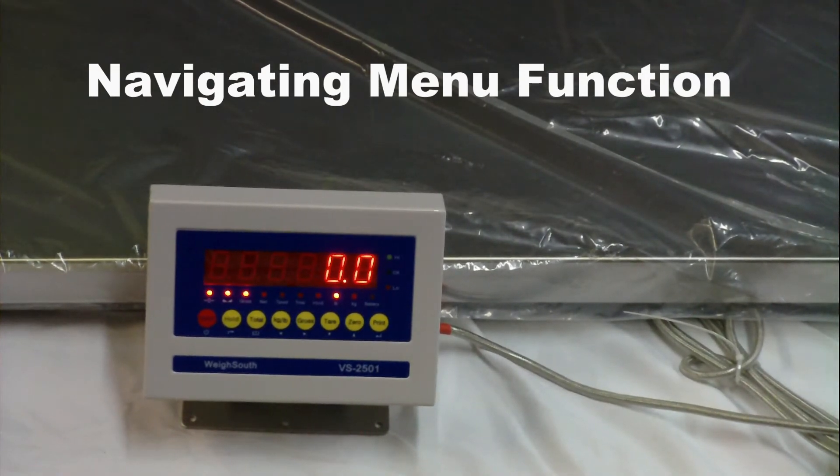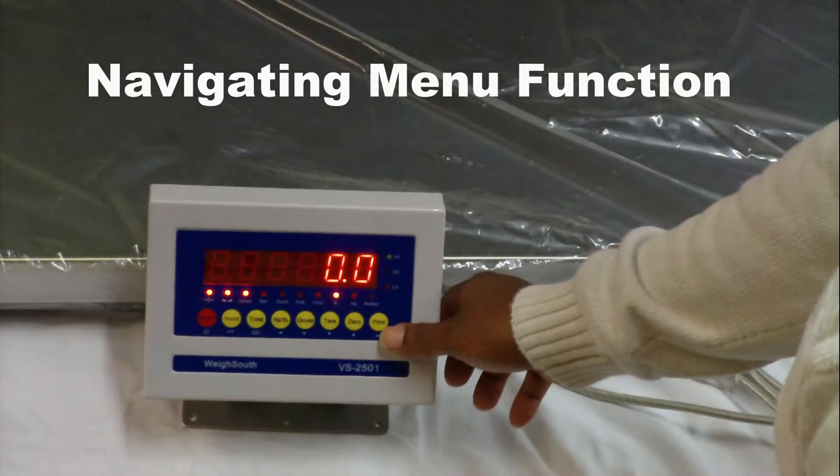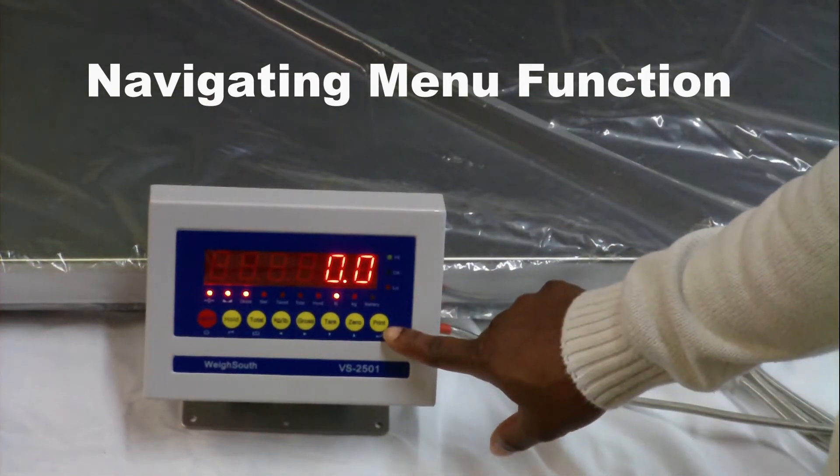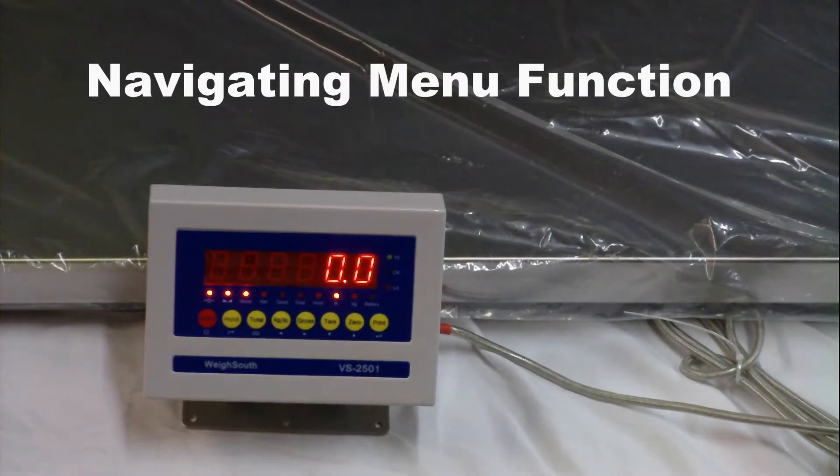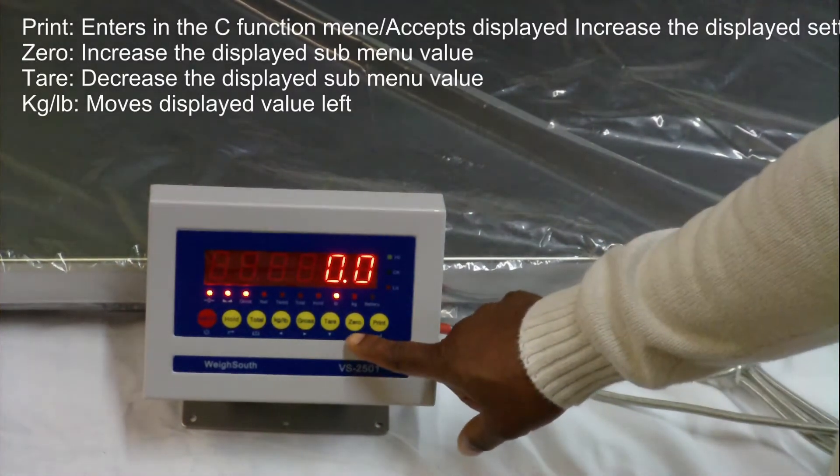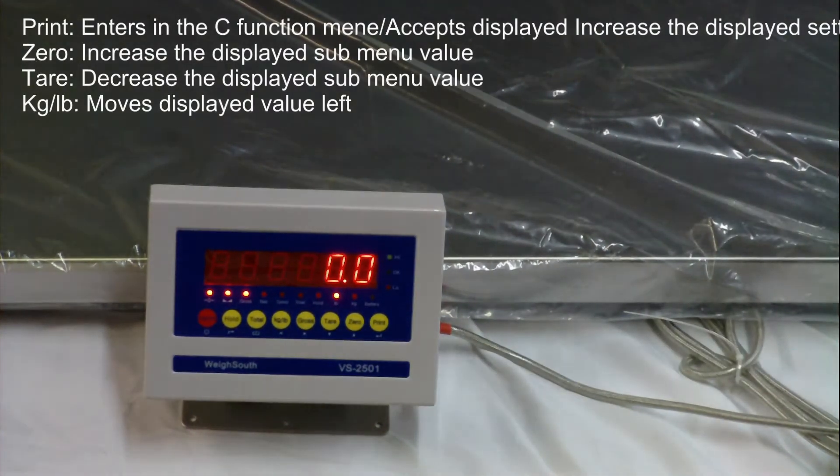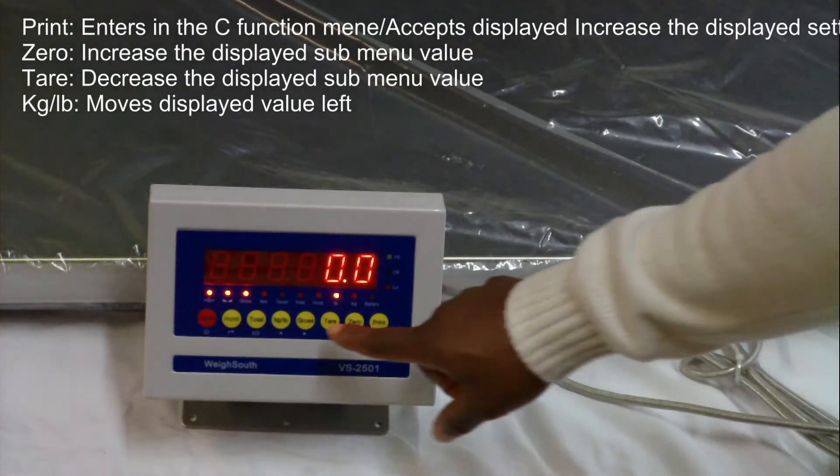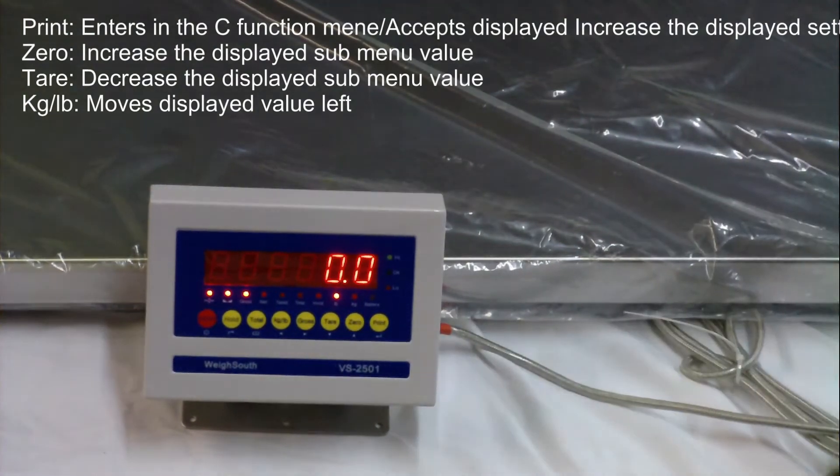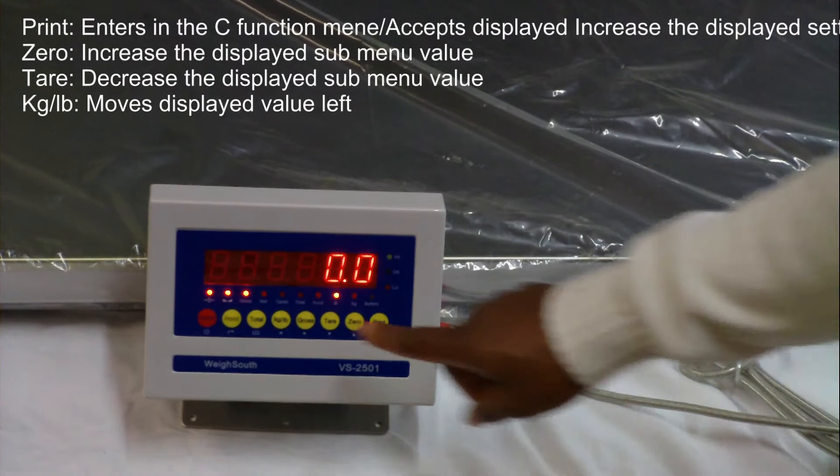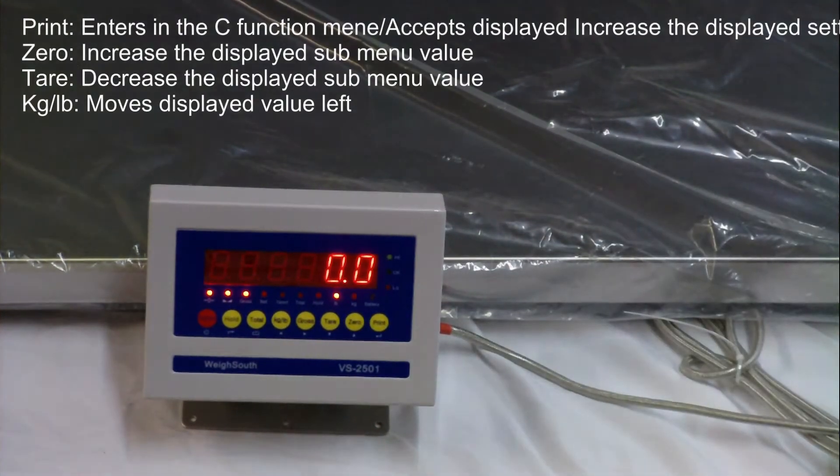The keys are labeled and the function is below. Print enters the C function menu and accepts the displayed setting. Zero increases the displayed submenu value. Tear decreases the displayed submenu value, and kg pound moves the displayed submenu value left.